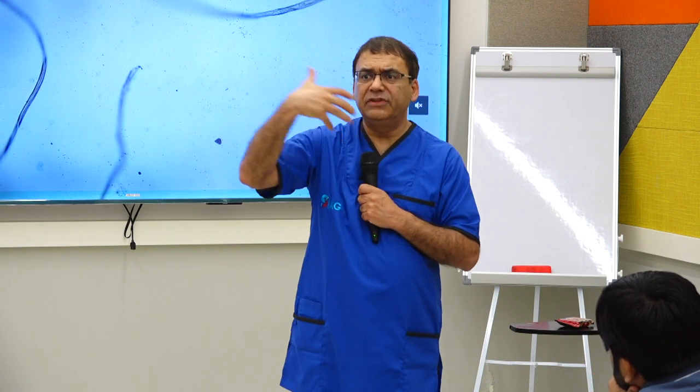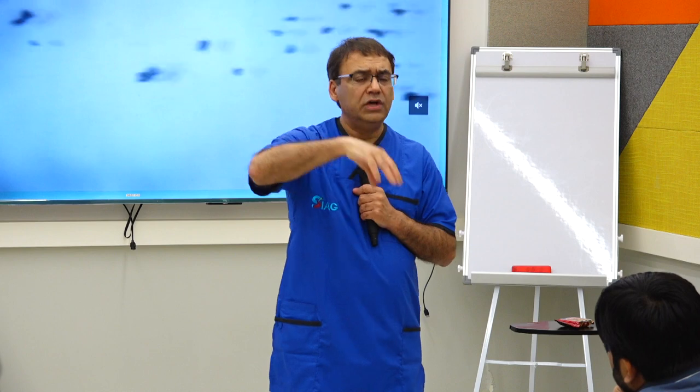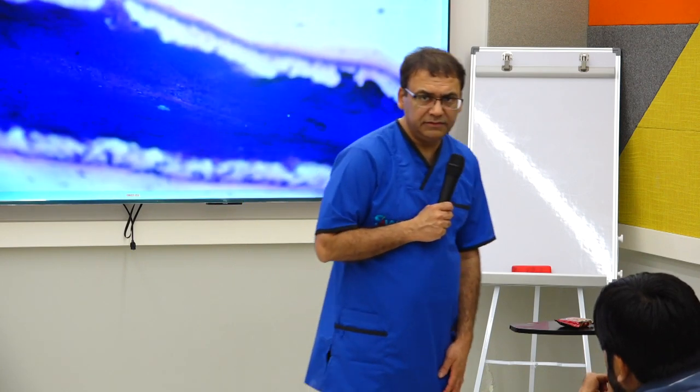If it's an FNA needle, we used to teach you gotta go four times in one place, do it quick, and then change to different directions. So four different directions, each four times, that would be 16 times. Sometimes we use suction, other times we don't use suction. With the FNB needle, you will feel it when the tissue comes into the needle. You get that tactile sensation many times. But you don't need to go more than once or twice in one area, and three to four different areas should be good enough with the FNB needle.